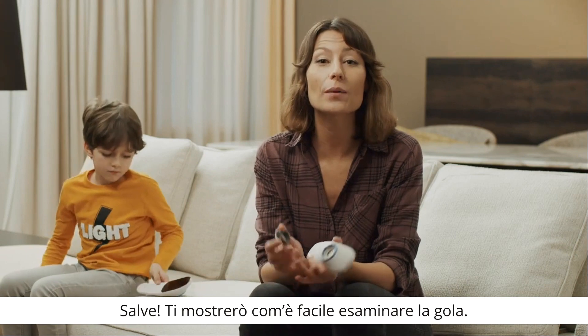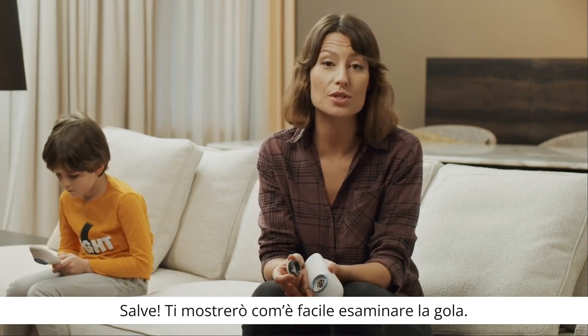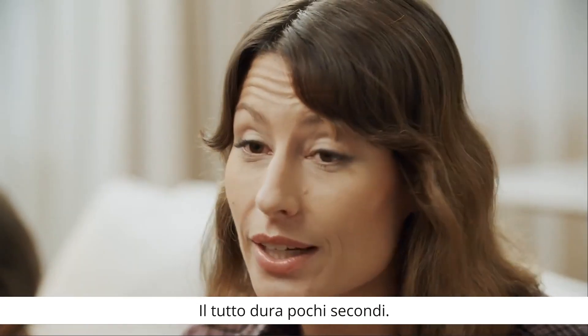Hi! Now I'm going to show you how easy it is to examine the throat. The whole process takes only a few seconds.